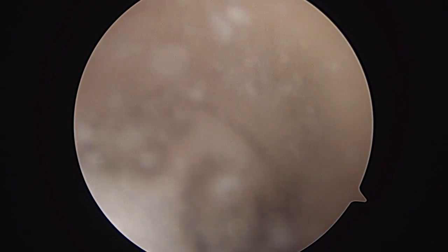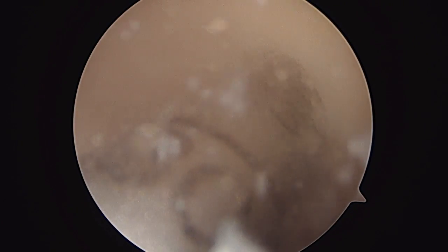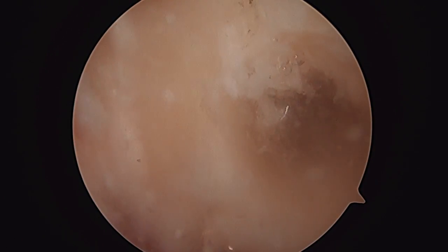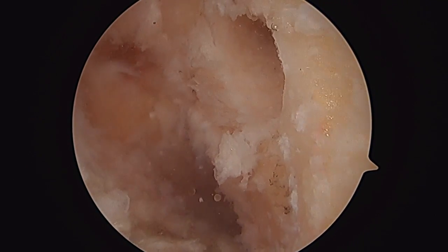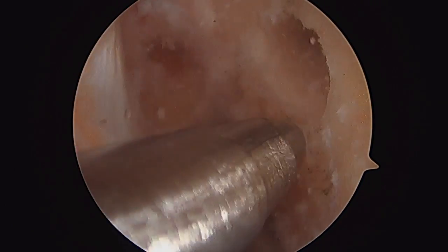ACL footprint. There's a lot of other advantages to this, with only temporary need to hyperflex the knee during the actual drilling, but ingress of the reamers into the knee can be done at a less flexed place. So in this instance, I back the pin up into the tunnel, which I'll show you better going forward, but I can check my landmarks.